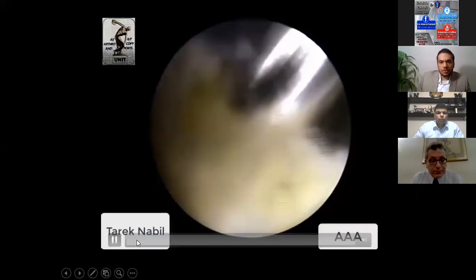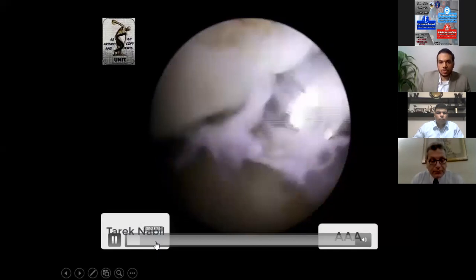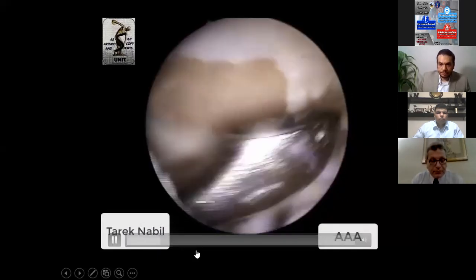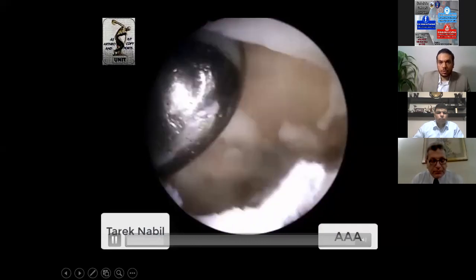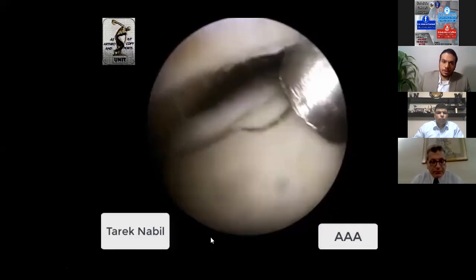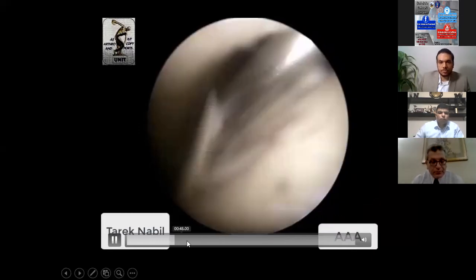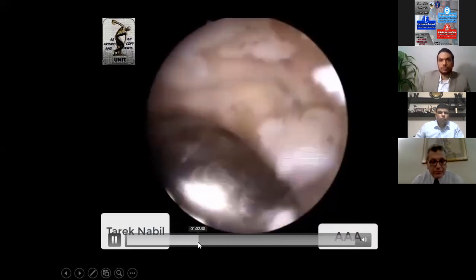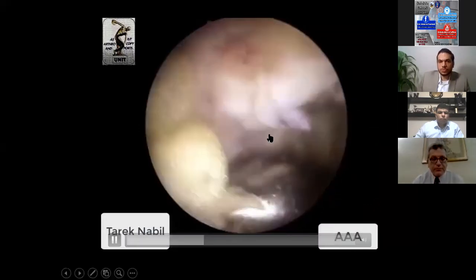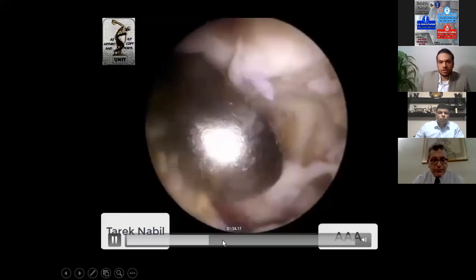This is the arthroscopic ankle arthrodesis: creation of the working space first, anterior ankle arthroscopy, then removal of the articular cartilage from the tibial plafond. This is all done through the dorsiflexion technique. No distraction was needed. And then denuding the cartilage from the talar dome using a variety of curettes and arthroscopic osteotomes, also from the lateral gutter or the inner aspect of the lateral malleolus.